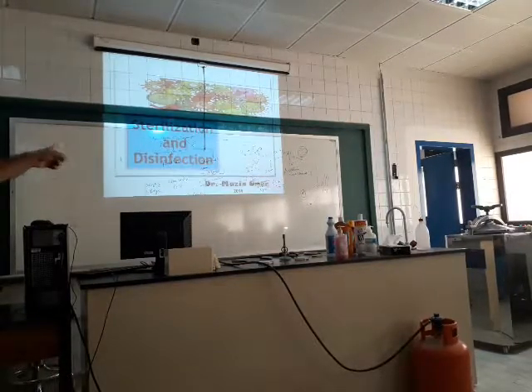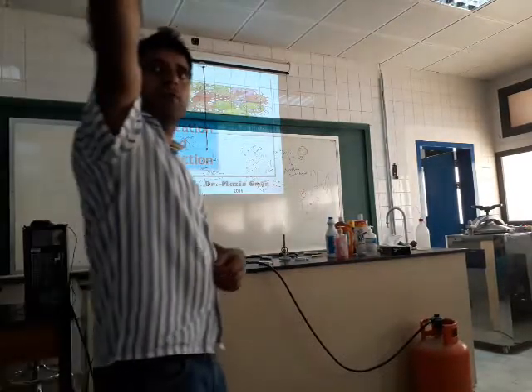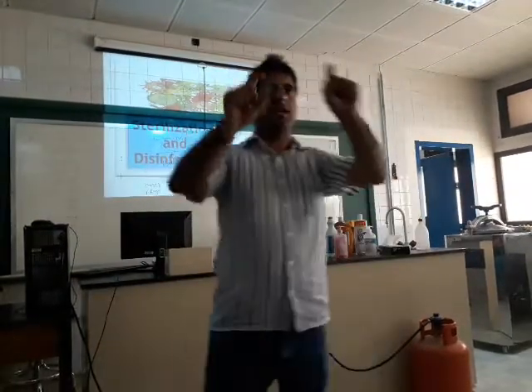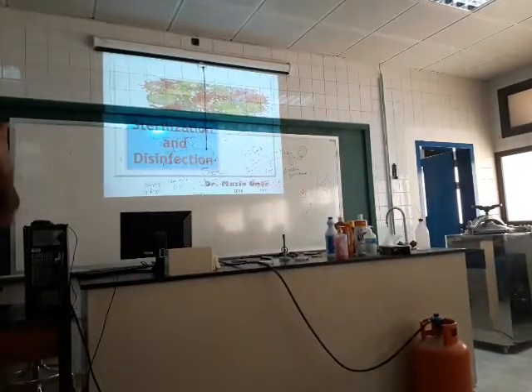They are very effective for catheters, bed linings, and cotton that we use in hospitals, because they have the capability to destroy all forms of life. And this is called the laminar flow, the machine behind you. Inside there is a UV lamp. The UV lamp also works on radiation, but it destroys the microbes, but not the spore.